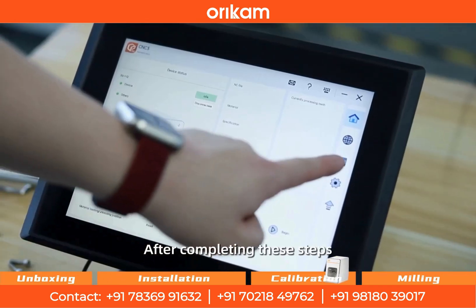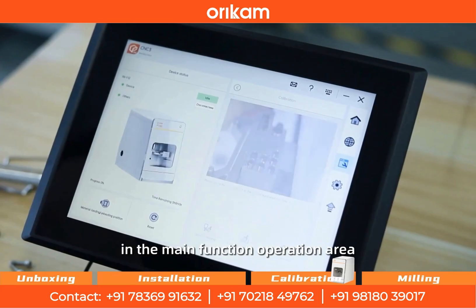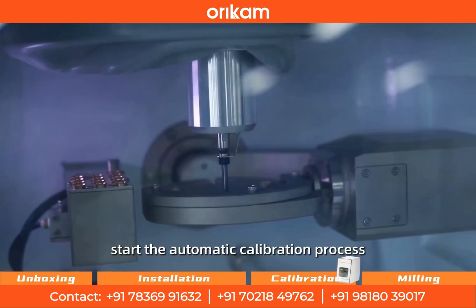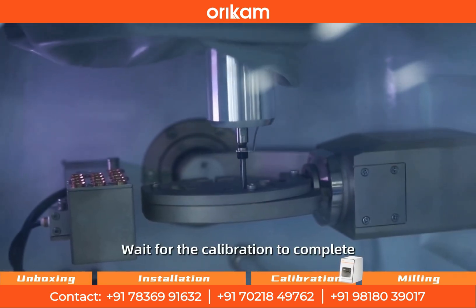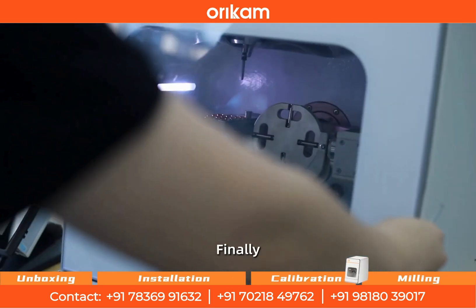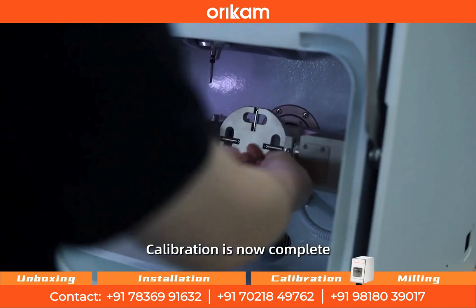After completing these steps, click the calibration button in the main function operation area. Then click next to start the automatic calibration process. Wait for the calibration to complete. Finally, remove the calibration disk. Calibration is now complete.